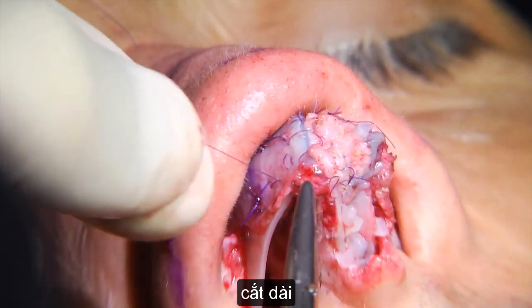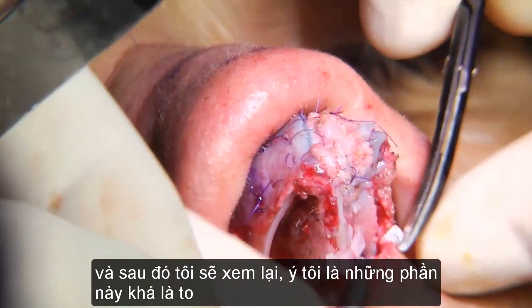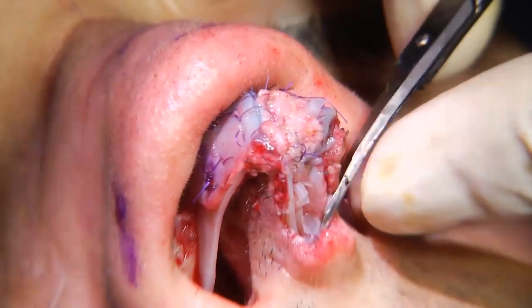And then I'll see if I can. I mean, these segments are just too big.